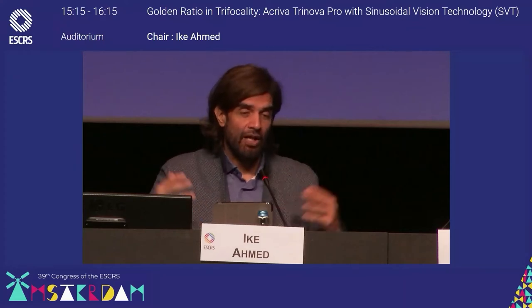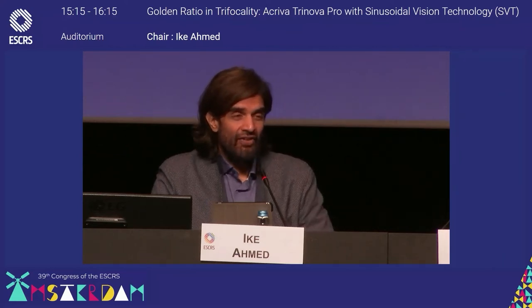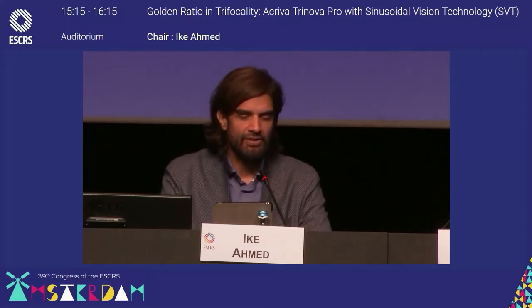I do like having binocular summation. I think you've shown it here. I prefer to do both eyes at the same time if I can. Patients will always say, you know, this eye feels drier a little bit, I have ptosis, it's because you put this lens in and not in the other eye. Whatever the reasons are, right? So I think it's just generally a good idea with both eyes. People like to have both eyes kind of similar in that way, in my experience.